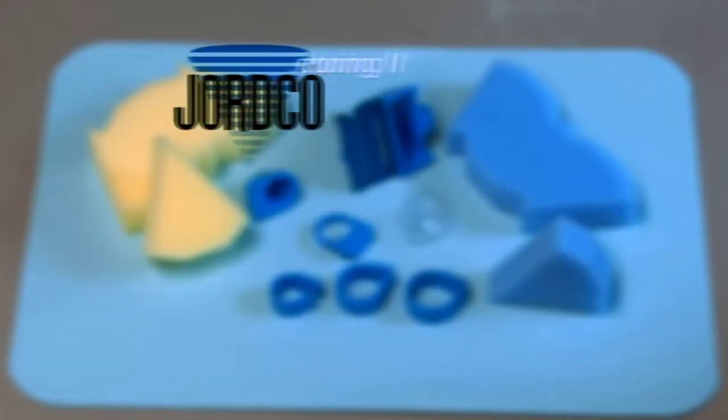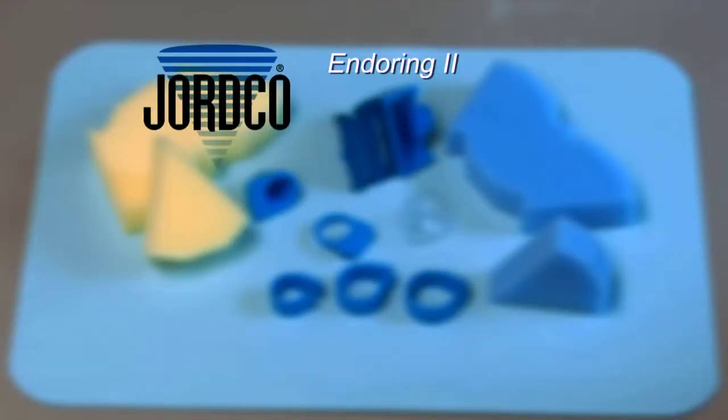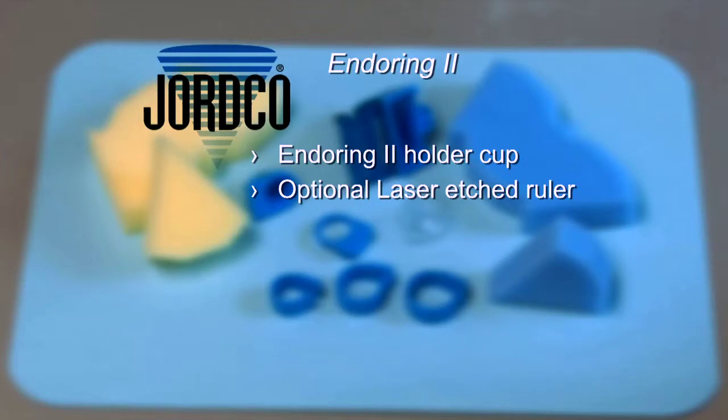The Ender Ring 2 by Jordco consists of the following components: the Ender Ring cup holder with a built-in 30mm ruler or as shown with an optional 30mm laser etched metal ruler. The Ender Ring 2 also features a gel well system that includes either a solid reusable cup or a single use clear cup and supporting adapter ring.